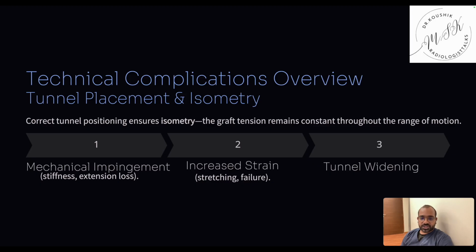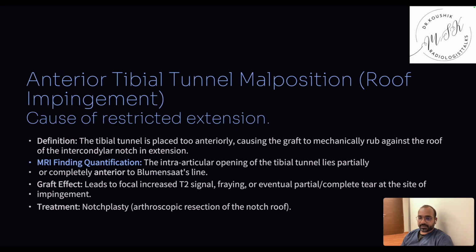Tunnel malpositioning. Because the tunnel is not correctly positioned, the graft can go either into strain, that is tension, or stretching, or stiffness. So because of that, there is abnormal stretch. There is difficulty in extension of the knee joint, and also tunnel widening.